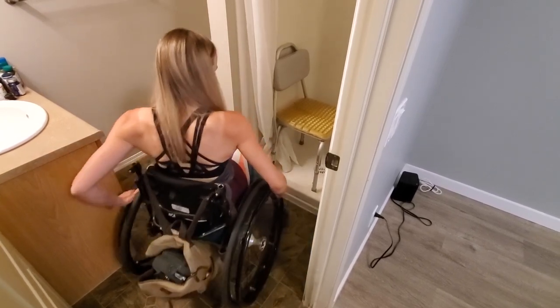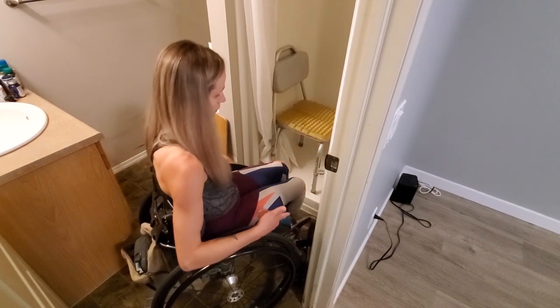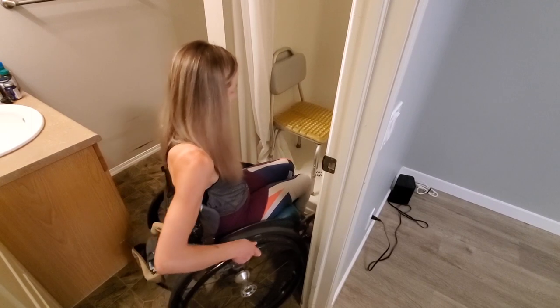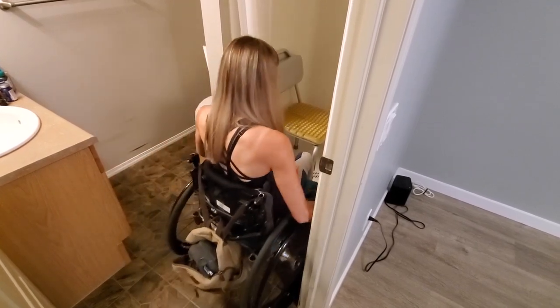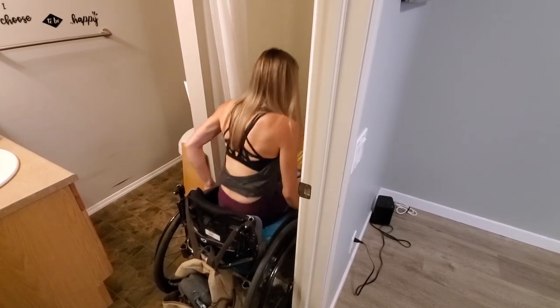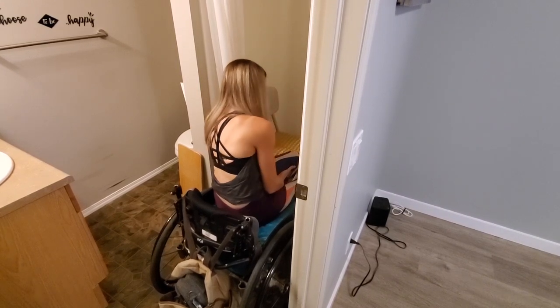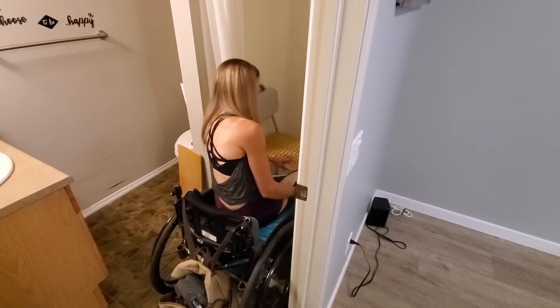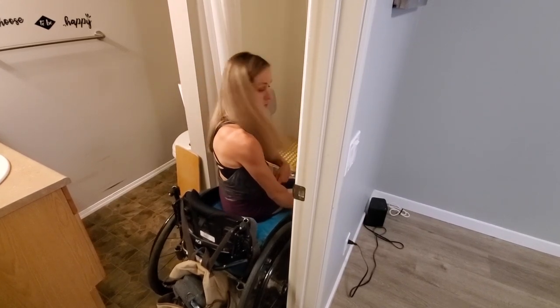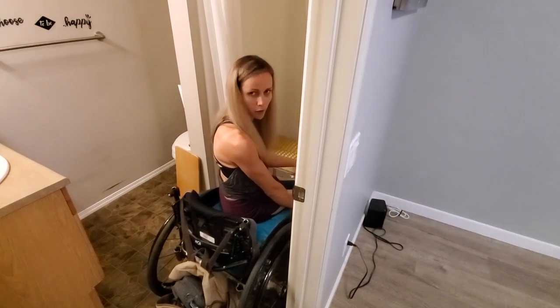So I get as far to the right side of the shower as possible with my chair and I just go straight on toward the shower. I get my feet inside the shower in front of my shower chair, and then I get my butt as close to the edge of my cushion as possible without falling off.